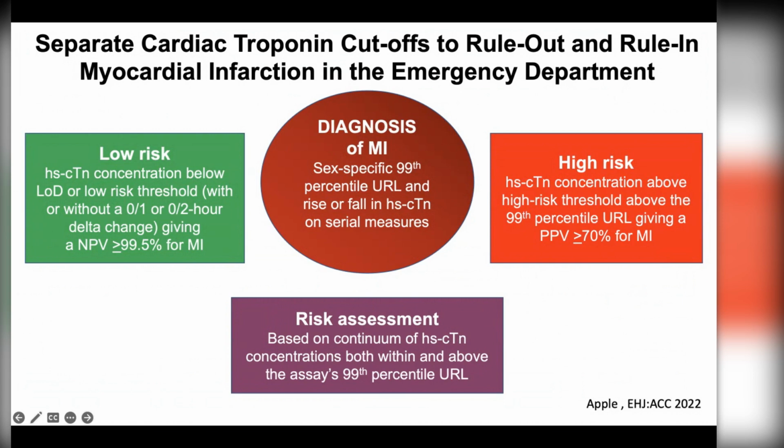The concept is that patients come into our emergency department and our ERs, or whatever we designate them, potentially low risk individuals, and how do we establish a threshold cutoff to potentially, with the right clinical picture, which we could never lose sight of, send patients home.